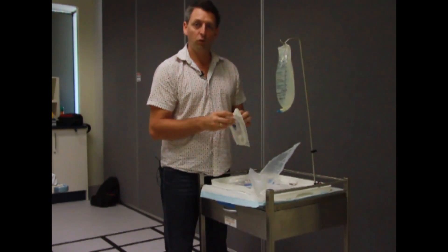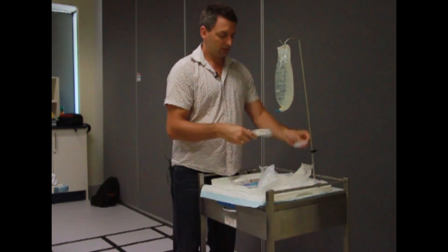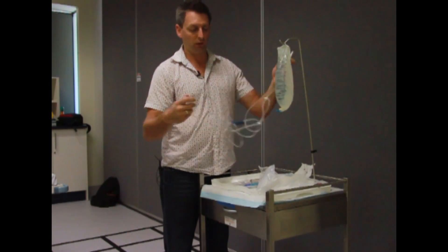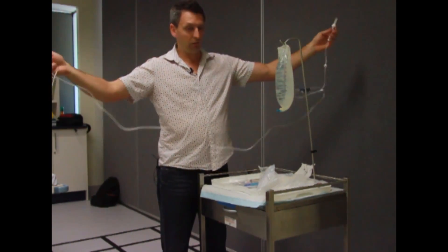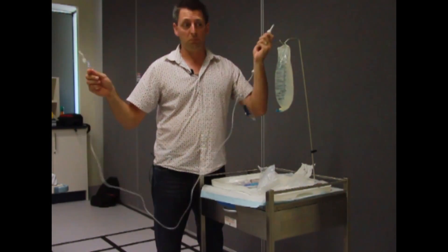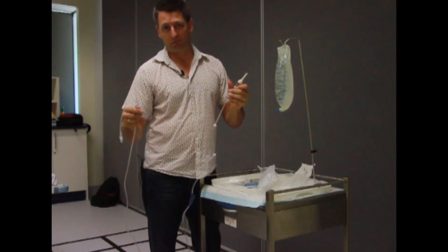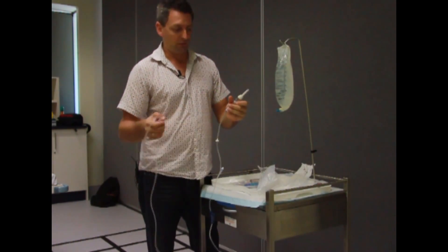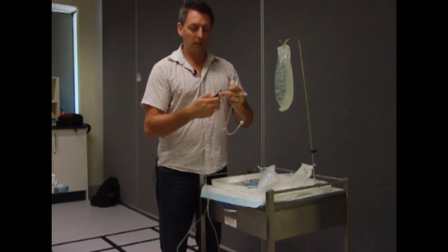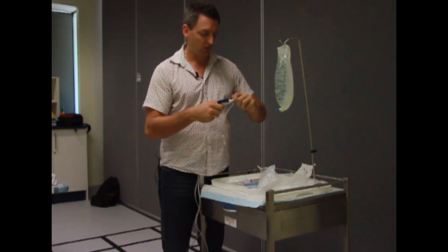My first one I'm going to do is a gravity fed line. Take out the line — it's all pre-packed ready to unroll. Never let the tip hit the floor; once it hits the floor it goes in the bin, because you don't eat off the floor and you don't expect to put IV fluids through someone's drip if it's fallen on the floor. Always — this is the catch — always clamp off first before you spike the bag, because otherwise you'll get air introduced into the circuit.